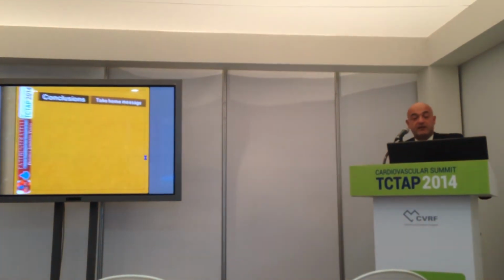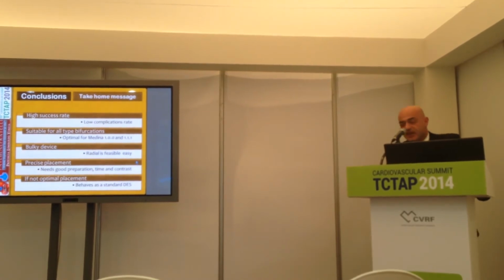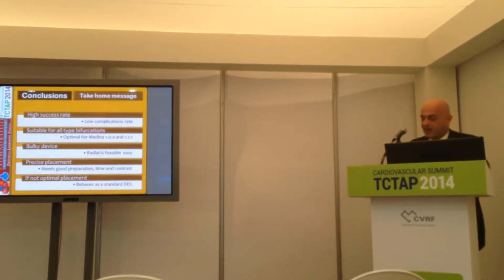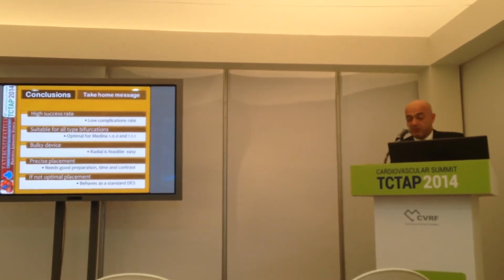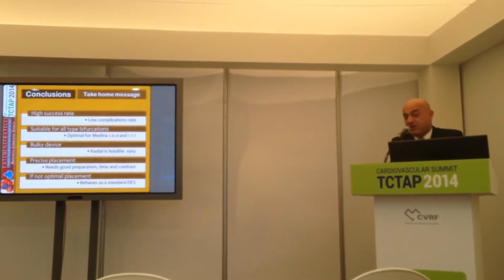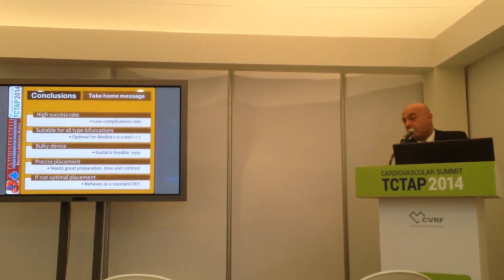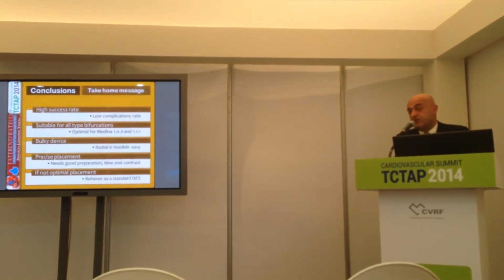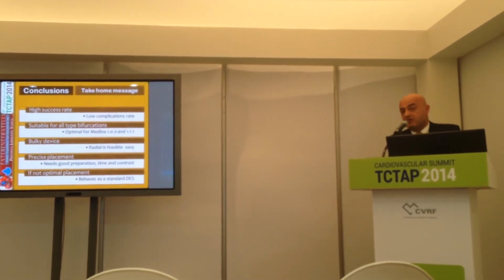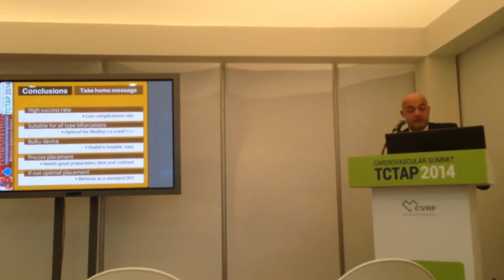At the end, what can I say? Well, I'm almost at the end of my presentation. So the stent confers a high success rate and low complication rate, and it's suitable for all types of bifurcation. I would say, especially if it's Medina 100 or Medina 111 when you decide to put another stent. Now I can say it's also good for 110 or 101 when the carina is involved. So with 1 stent you can resolve the problem.